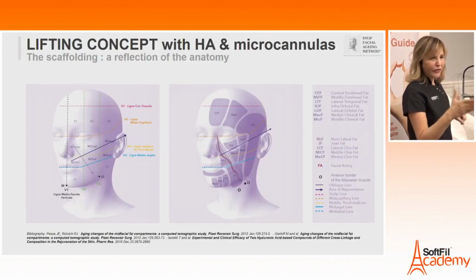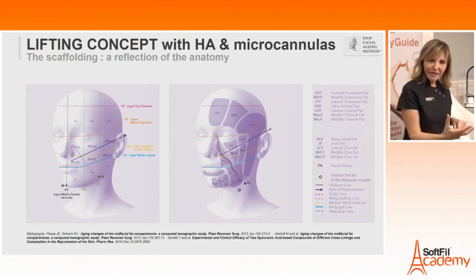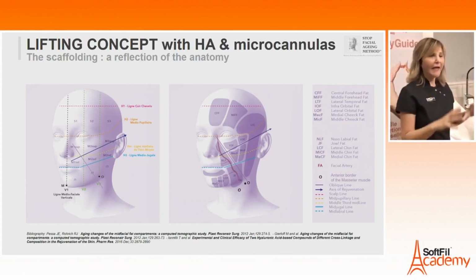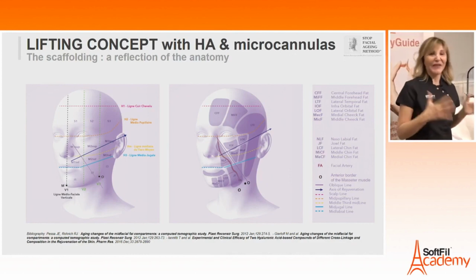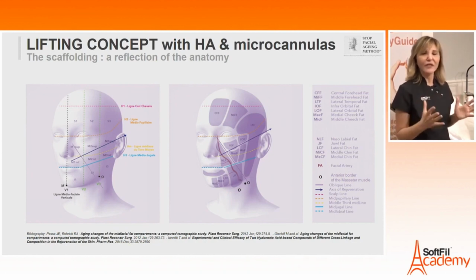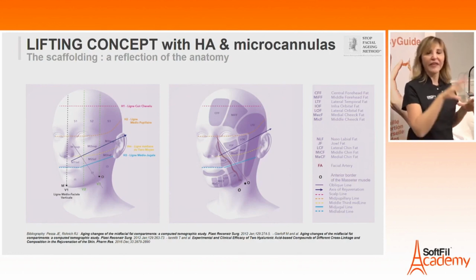So now here you can see on this slide what I offer you when I propose this method. It's the lifting concept. Why? Because you know that, of course, on the face we have many fat compartments, and when our patient is relatively young, I think I can go until 60 years old. Now you know that we can treat many patients until 80 years. I think until 60 years old you will have a very good result, because all compartments are stretched together. And when I inject one area of the face, I will lift the adjacent zone, as you know.